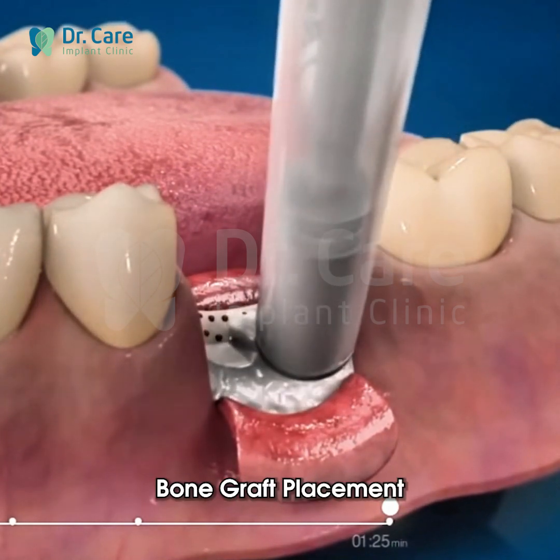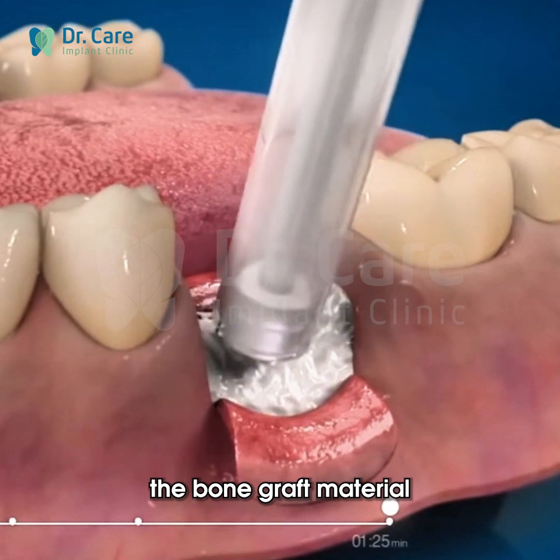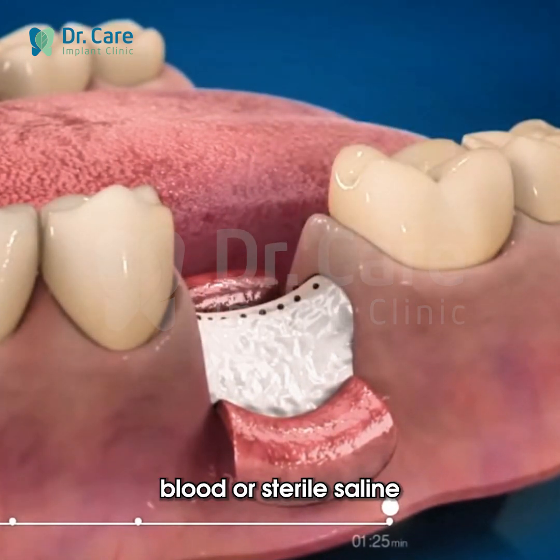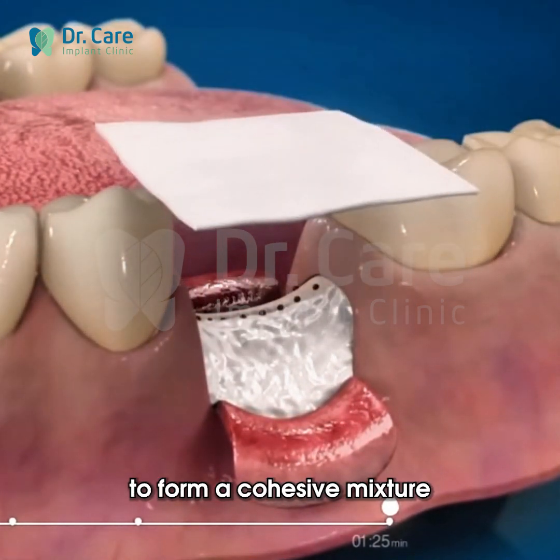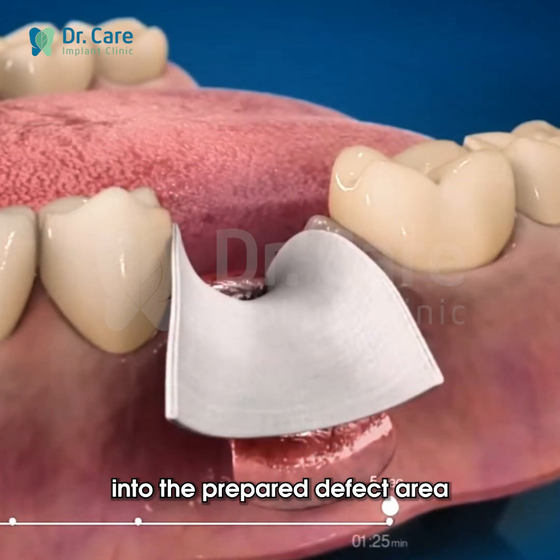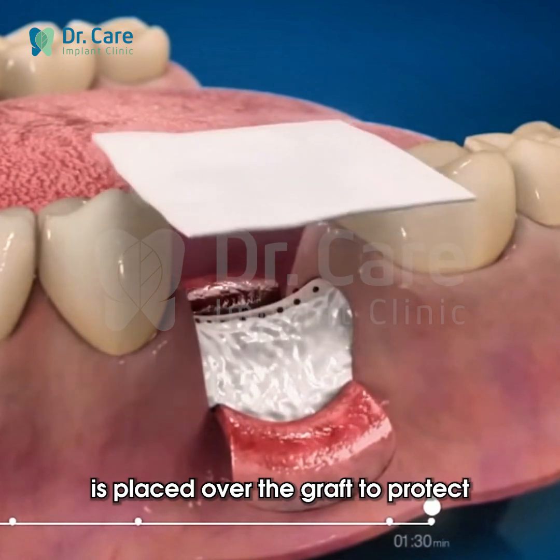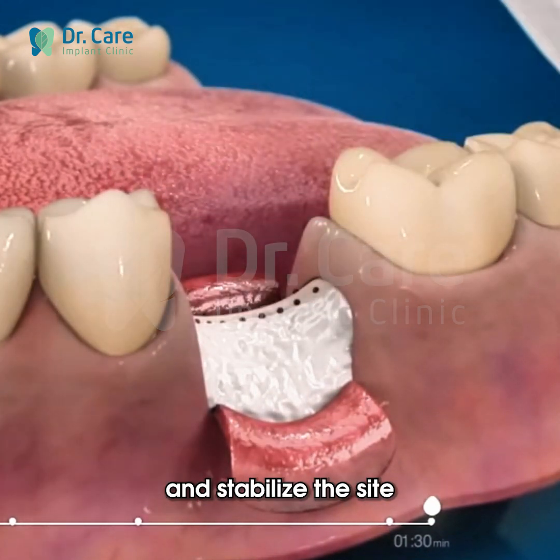Step 4. Bone graft placement and membrane coverage. The bone graft material will be mixed with autologous blood or sterile saline to form a cohesive mixture, which is then carefully packed into the prepared defect area. A resorbable or non-resorbable barrier membrane is placed over the graft to protect and stabilize the site.